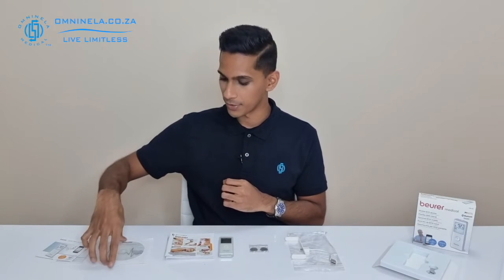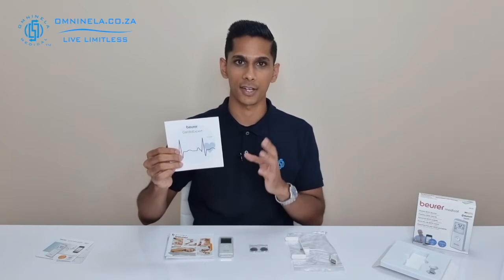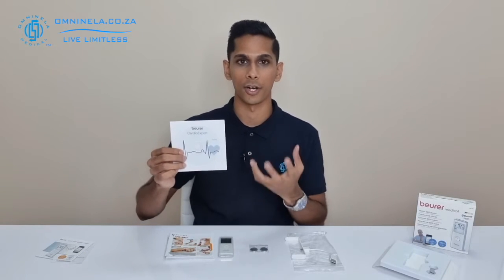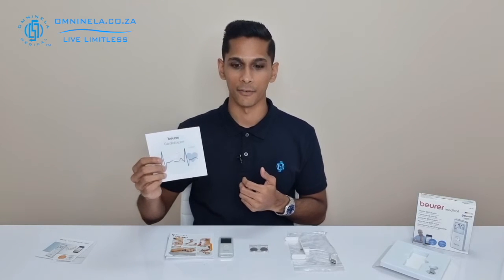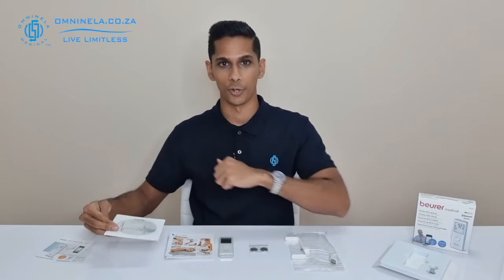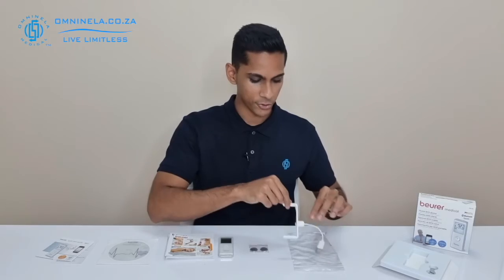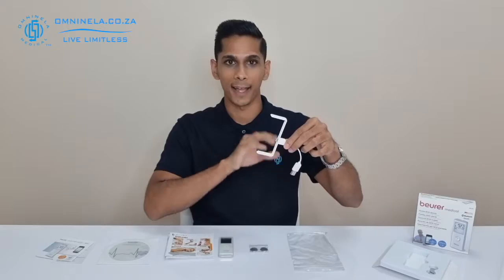We can also see that we have a CD included inside the packaging, and this will be for the Beurer Cardio Expert software that you can load onto your computer if you're going to be exporting information from the device to your computer.